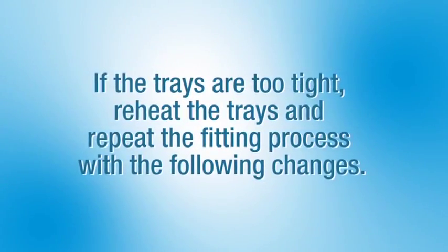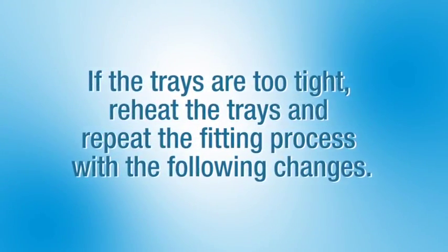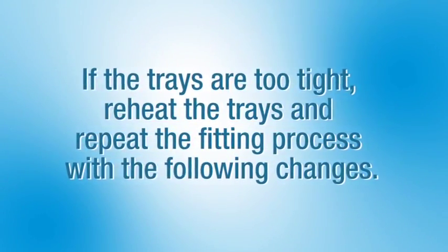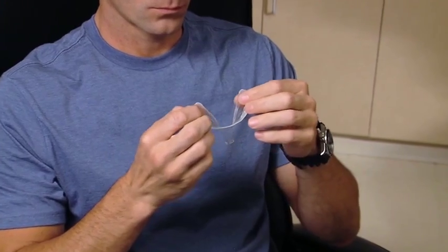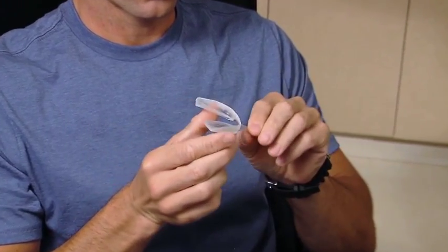If the trays are too tight, reheat the trays and repeat the fitting process with the following changes. Bite down with less force when seating the trays. Once the trays are placed in the mouth and are fitted to the teeth, move the trays side to side using the protruding hardware. If the trays are too narrow or too wide, reheat the trays and either squeeze the molar area of the trays together or pull it apart, depending on the size of the arch.